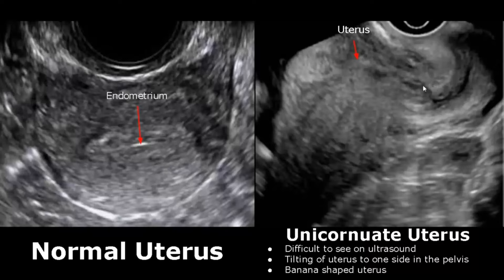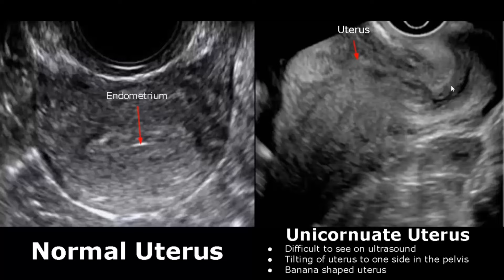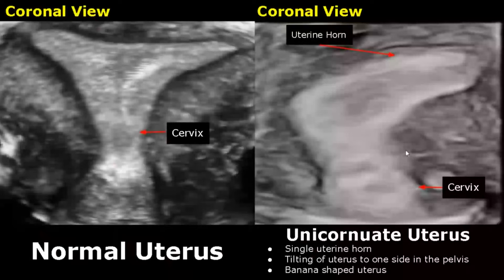A unicornuate uterus will have only one uterine horn connected to only a single fallopian tube. It is difficult to see on 2D ultrasound — we may see tilting of the uterus to one side in the pelvis. A unicornuate uterus has a banana shape and is seen very well in a 3D coronal image, where only a single uterine horn is found and the banana-shaped uterus is tilted to one side.